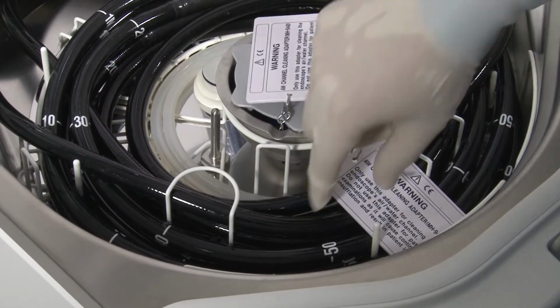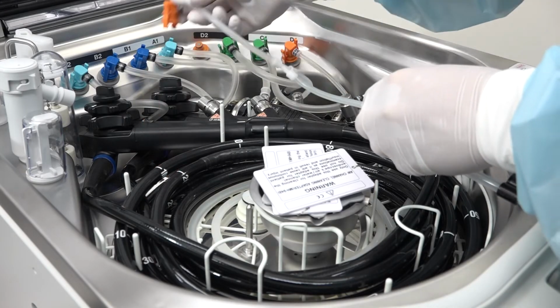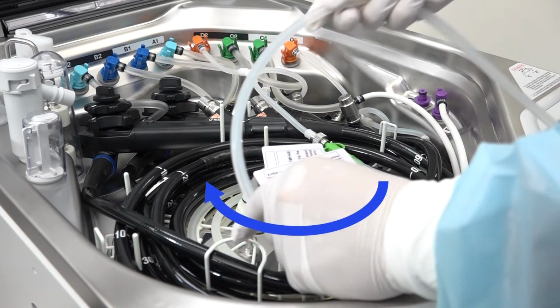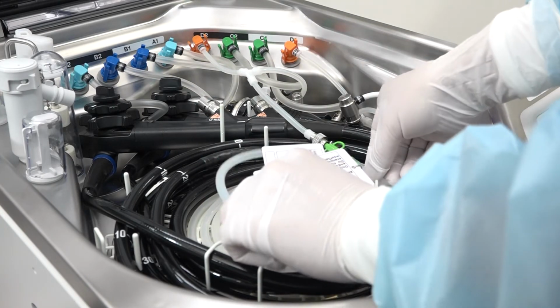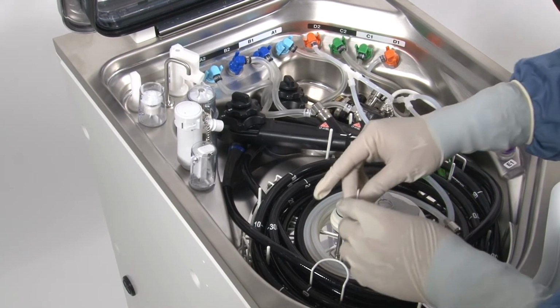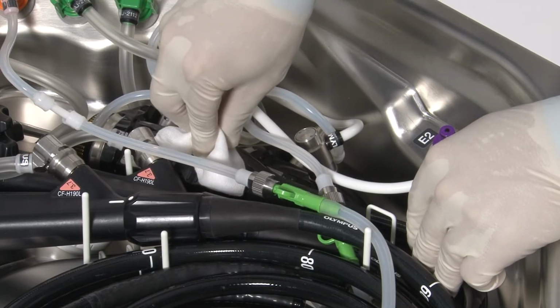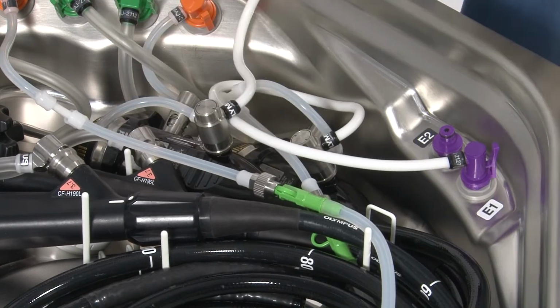Before setting the auxiliary water tube, temporarily place the indicator plate of the AW channel cleaning adapter on the washing case while loading the auxiliary water tube. Wrap the auxiliary water tube clockwise in the inner area from the universal cord in the same way as for the first endoscope. After setting the auxiliary water tube, place the plate in the original position. Please connect the leak test tubes to the second scope and the OER ELITE in the same way as for the first endoscope.